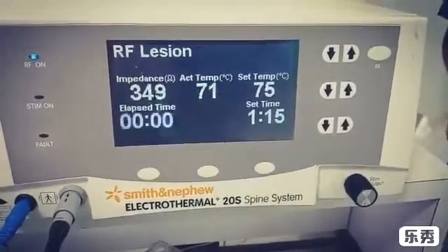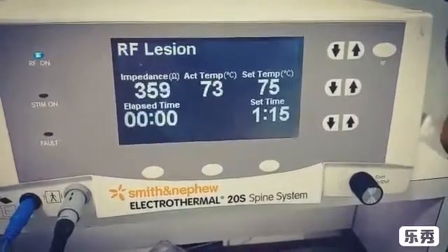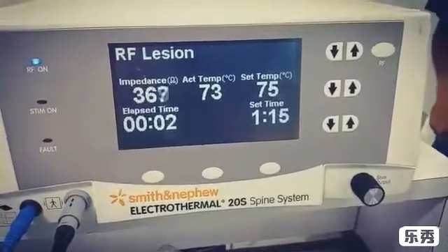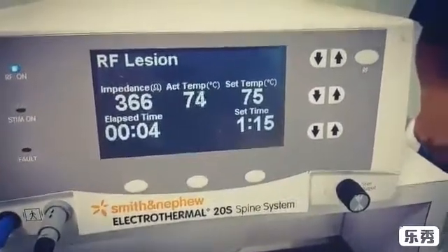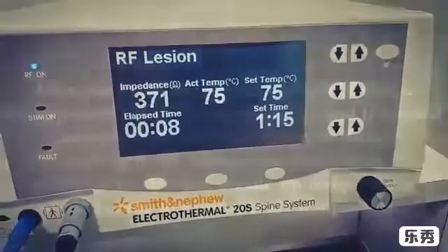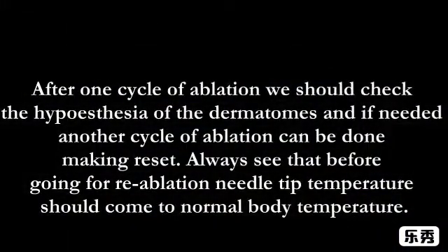You can see the temperature is increasing. Once the needle tip temperature reaches the set temperature, the RF timer starts. Once it completes 75 seconds, it will automatically stop.